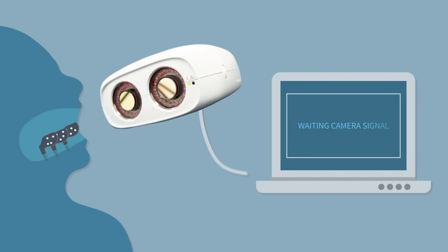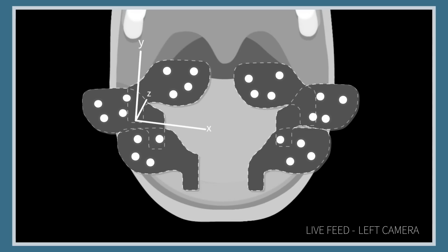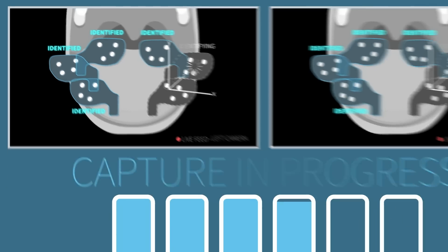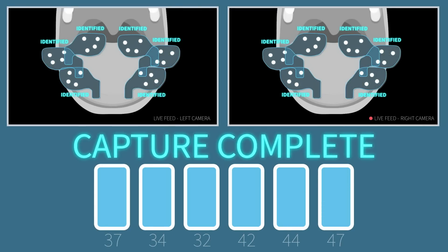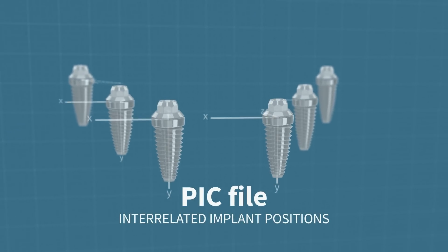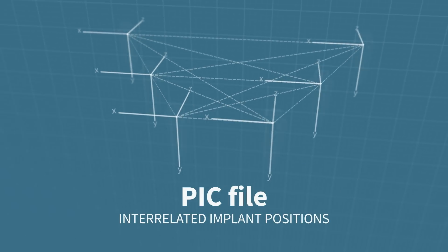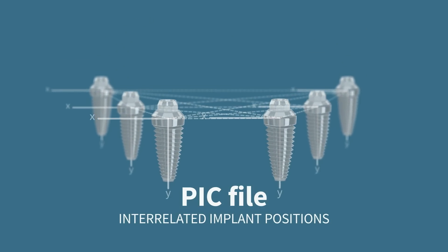The PIC Camera is approached to the oral cavity and the capture begins automatically. Instantly, the PIC abutment positions are identified, and their relative distances and angles are measured. A notification appears in real time when all the necessary data has been acquired. The results are immediately exported to a PIC file that contains the exact positions, angles, and interrelated distances between the implant platforms.